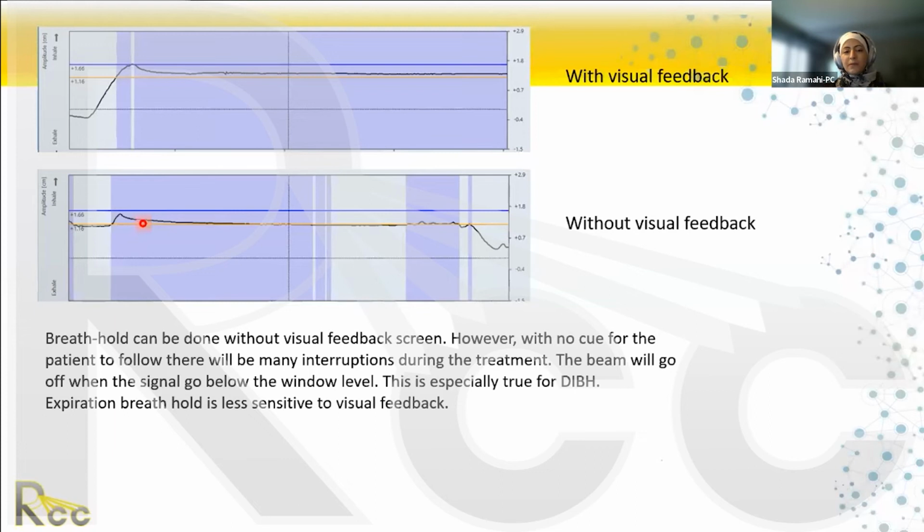If it's reasonable, meaning we can get the tumor to where it's supposed to be, we can align both images to the tumor, and there is not much difference in the location of the normal tissue. The lung is maybe a little bit more or less in volume, but not much of a difference. And if it's a tumor near a chest wall, or a tumor near the midline, that we're still getting. I'm sorry.